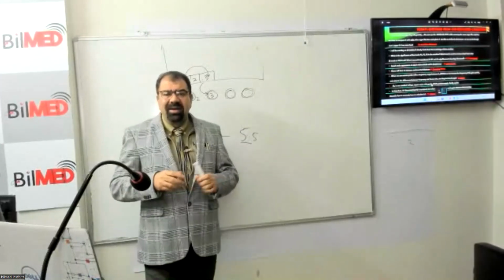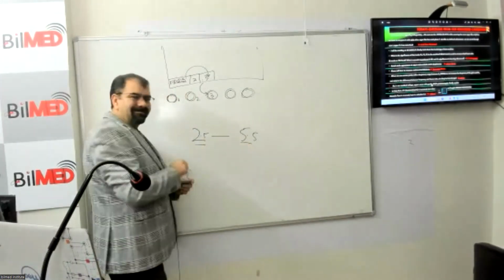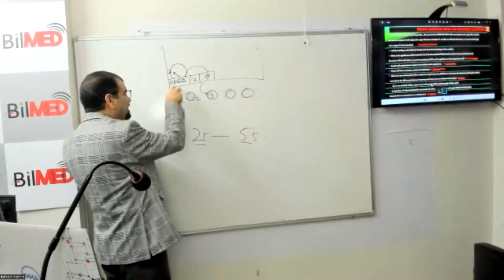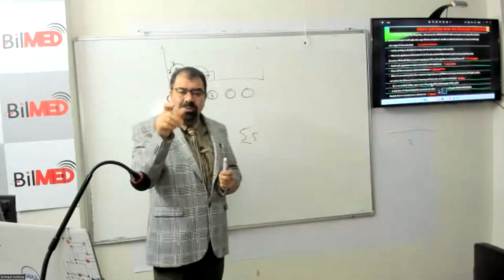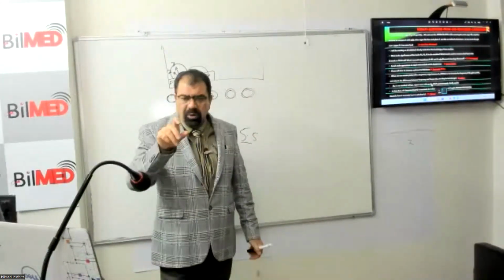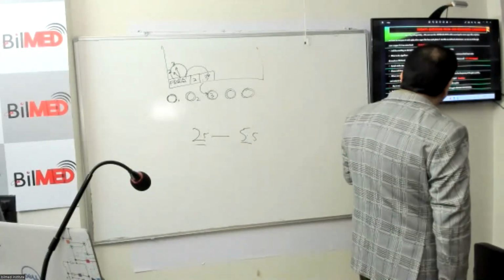Now, the point here is that when I rotate this knob clockwise or anti-clockwise, the frequency will increase or decrease. A pop-up will appear over here with a scale showing you that for now, it is 2. And when you rotate this, the scale will show you that we are using 3. So it is that frequency knob which you have to rotate to adjust the frequency. When to adjust, for what to adjust, that is already covered. So it is the frequency knob which will be rotated clockwise to increase and anti-clockwise to decrease the frequency. So Dr. Jadhav's question is complete.